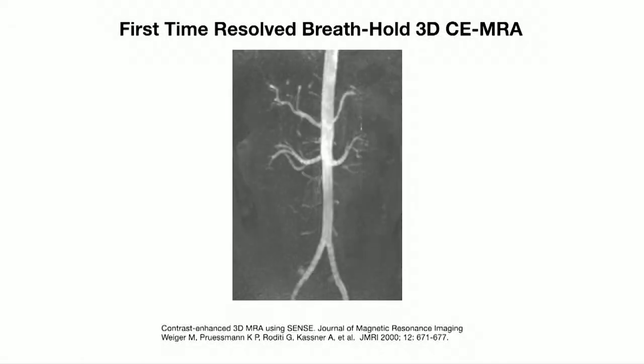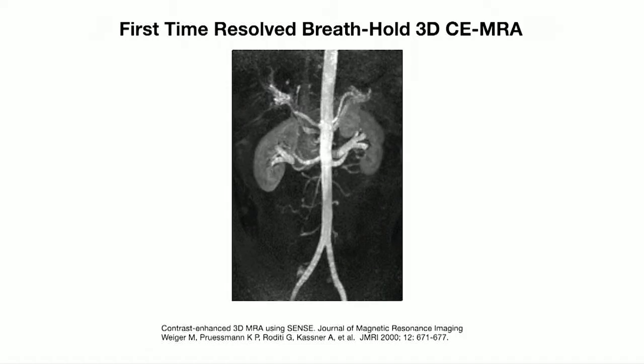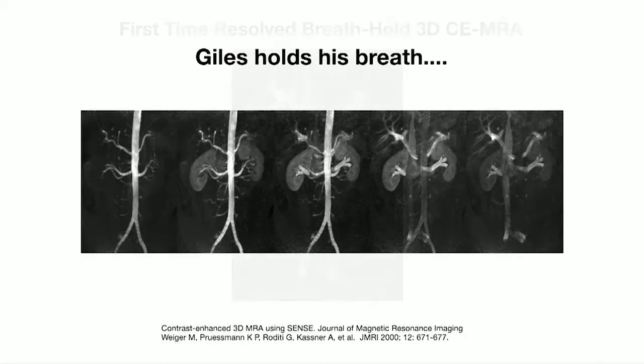I did show this morning, but I'll make no apologies. So this is the first time-resolved breath hold contrast enhanced MRA. This is me holding my breath for 40 seconds. And this was the first example of using SENSE to accelerate contrast enhanced MRA enough that we could actually do that.